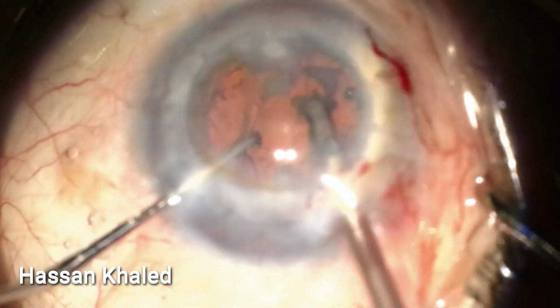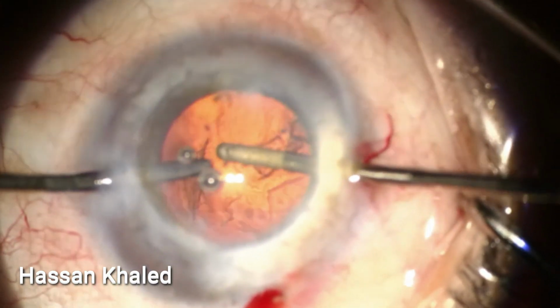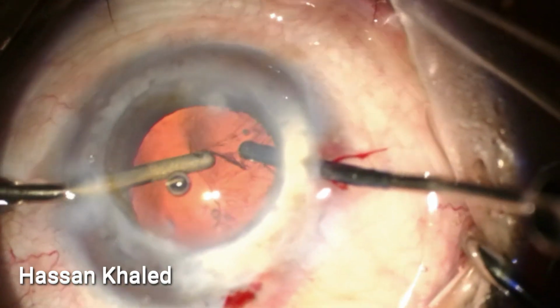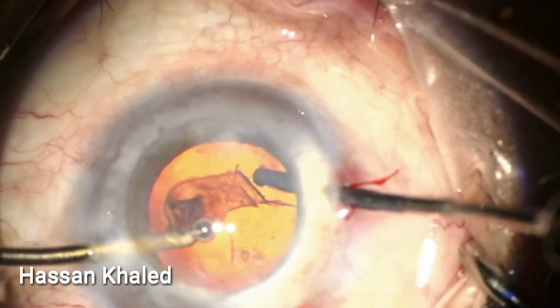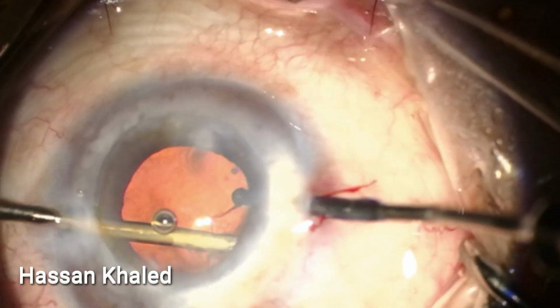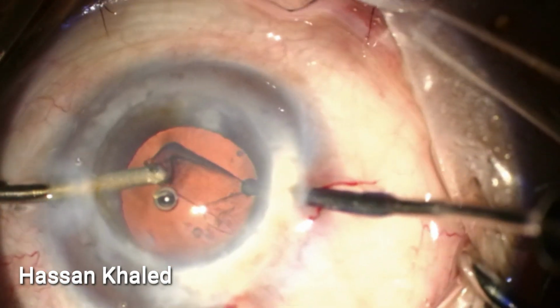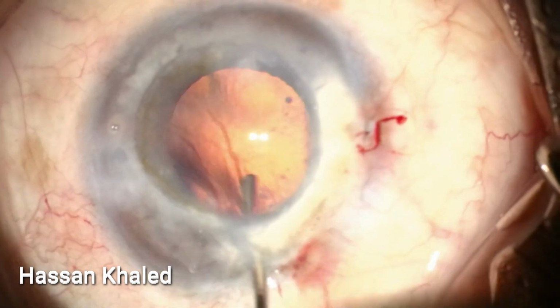the dense nucleus. Then, by manual irrigation and aspiration, removing the cortex, and here also try to avoid hitting the back of the cornea with the irrigation flow while holding the irrigation probe. As we can see also, I prefer to use a low aspiration flow rate while removing the cortex.